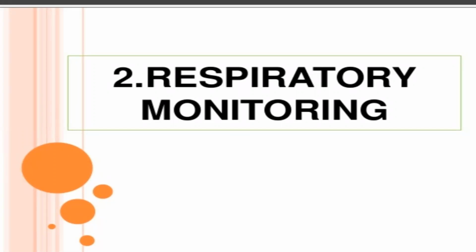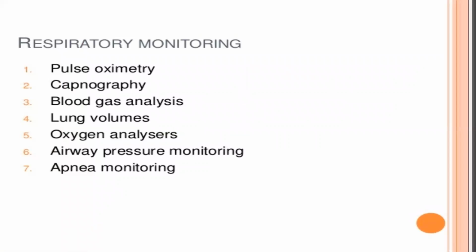Respiratory monitoring. Respiratory monitoring includes pulse oximetry, capnography, blood gas analysis, lung volumes, oxygen analyzers, airway pressure monitoring, and apnea monitoring.